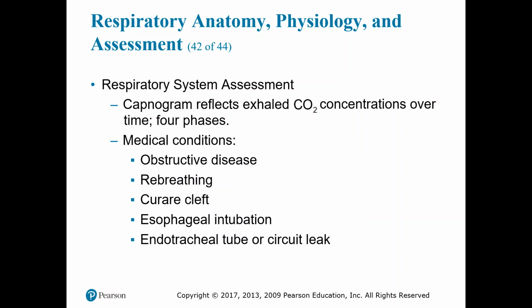Rebreathing of gas can result in the failure of the capnogram to reach the baseline. Baseline should always be 0 in a normal, healthy adult. You should always see your waveform return to 0 for phase 1. If we're rebreathing CO2, this won't happen. There will always be an end-tidal measurement. This can be due to hyperventilation or problems in the breathing circuit.